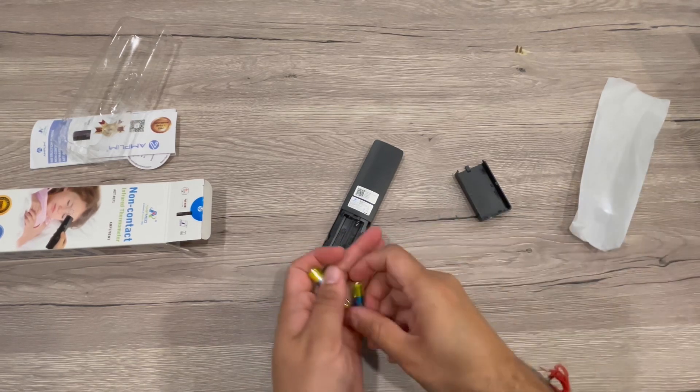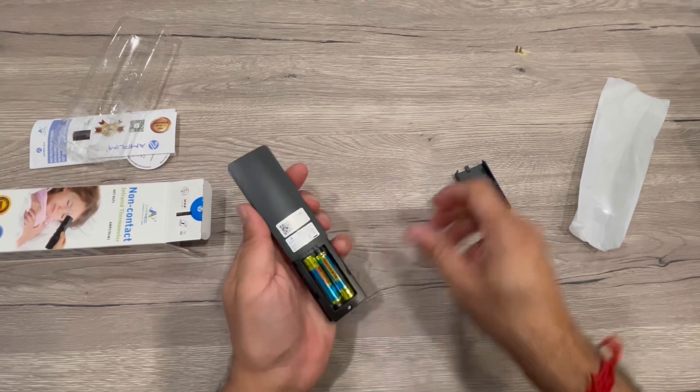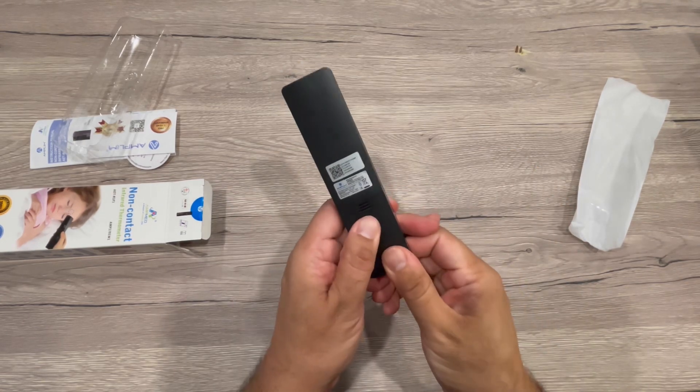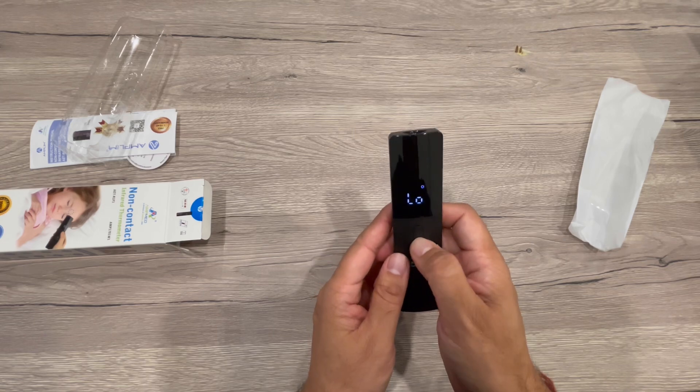Basically, it's a non-touch infrared reader. When your body is hot, you release infrared rays and it will just read that and give you a temperature. This is all set, so now I will start it.